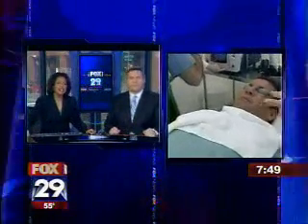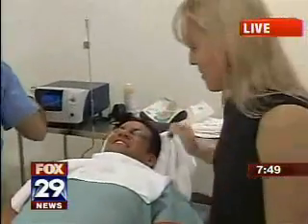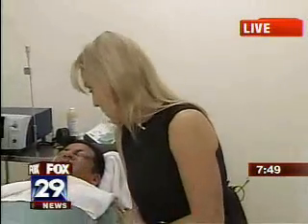I just wondered, does it hurt? He says it will not hurt. What they did, what you didn't see, is they put a lot of cream on TJ, and then they put Novocaine, like when you go to the dentist's office, into his eyes, and that's why he's all puffy. Bless his heart, he doesn't look this puffy normally. He didn't look this puffy when he came in this morning. And so basically, then they're going to put the laser in there, so he's not going to feel it. Dr. S told you you won't feel a thing.